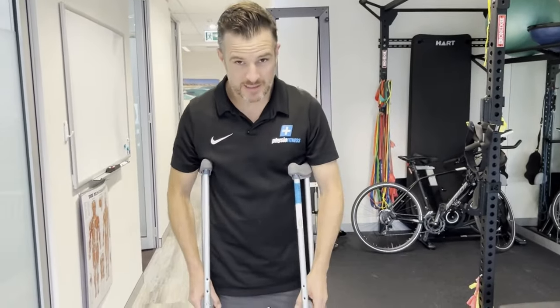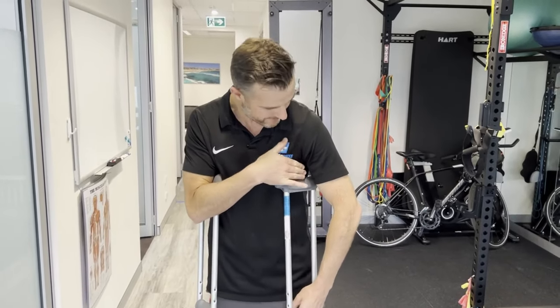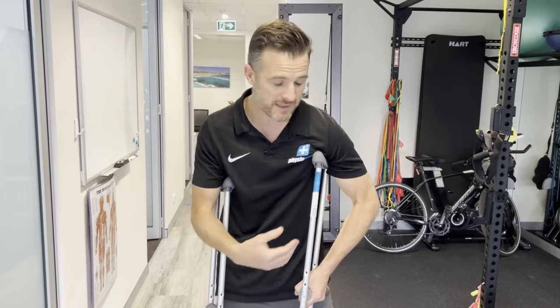A tip with these armpit crutches: make sure you've got about a three-finger gap at the top, because you don't want that crutch coming up into your armpit, as it's going to start causing nerve problems down through your arm.